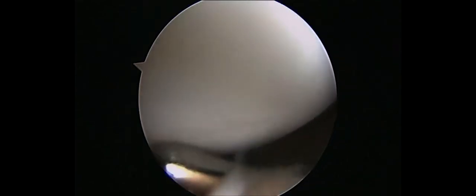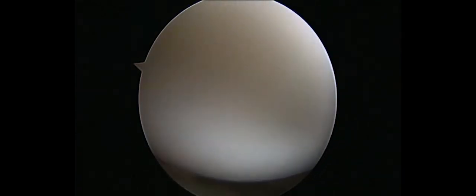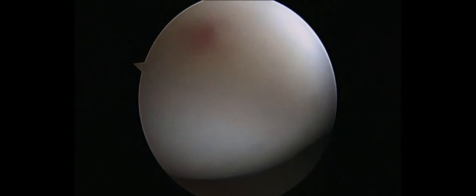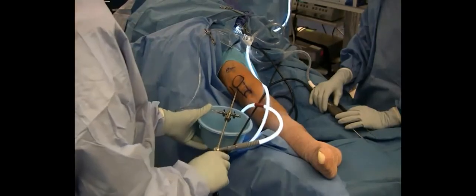When we are happy with the appearance of the cartilage, we then remove the arthroscopic instruments from the joint, and the procedure is concluded.